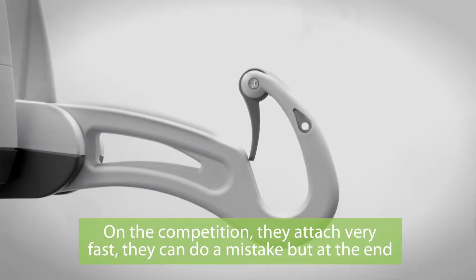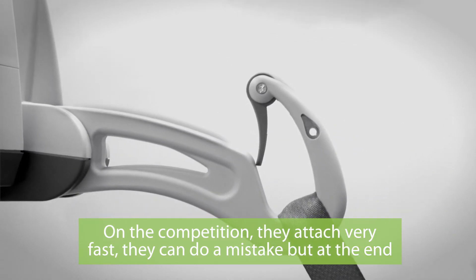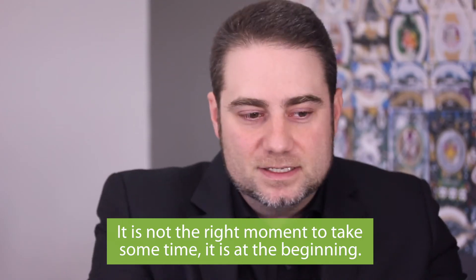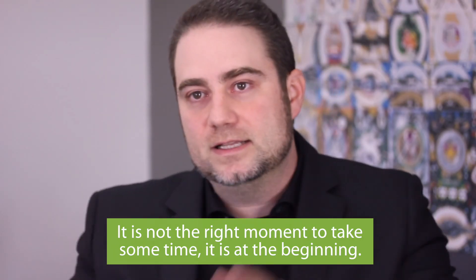With the competition, they attach very fast and can make mistakes, but at the end they need to spend some time to detach. That is not the right moment to take time — that's the beginning.